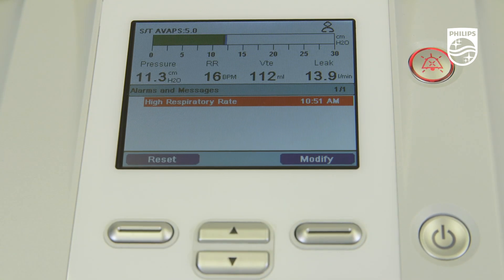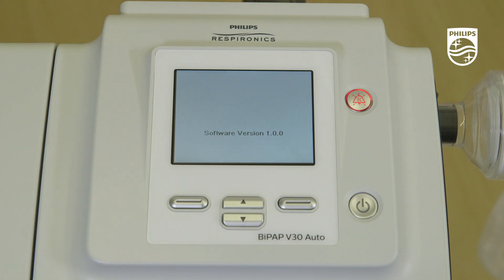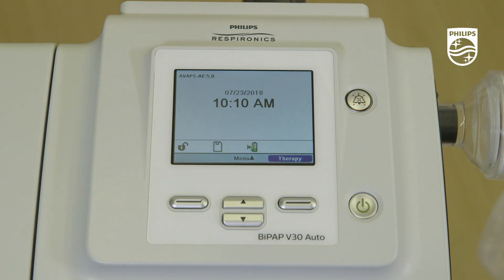Finally, the high respiratory rate alarm activates when the measured respiratory rate reaches or exceeds the selected setting.